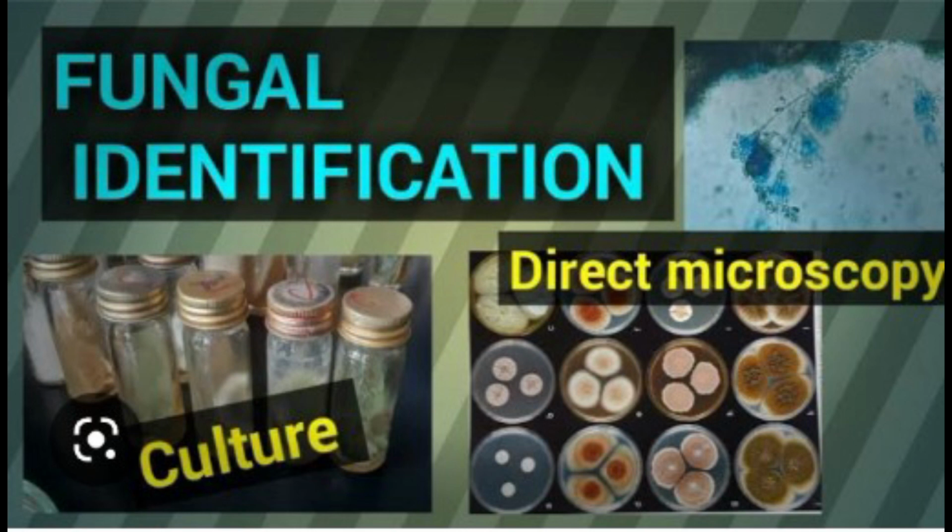Germ tube test. The germ tube test is a simple test to differentiate the pathogenic Candida albicans from non-pathogenic Candida species. Requirement: the yeast growth on SDA to be tested, test tubes, wire loop, fetal calf serum or rabbit serum, culture of known Candida albicans on SDA as positive control, and culture of known Candida parapsilosis on SDA as negative control.